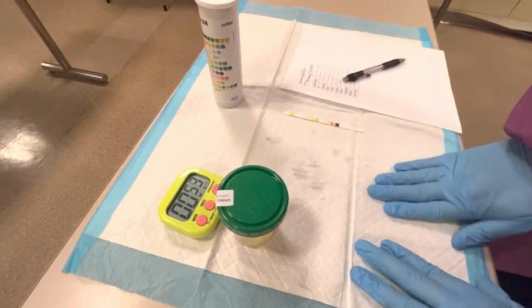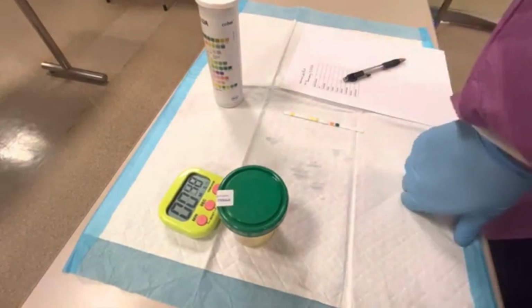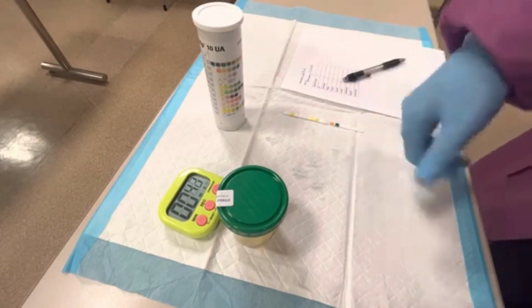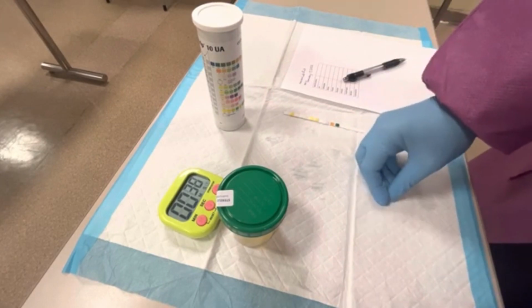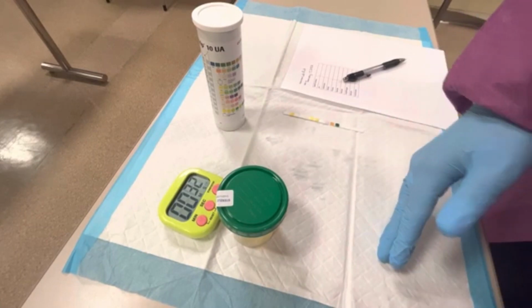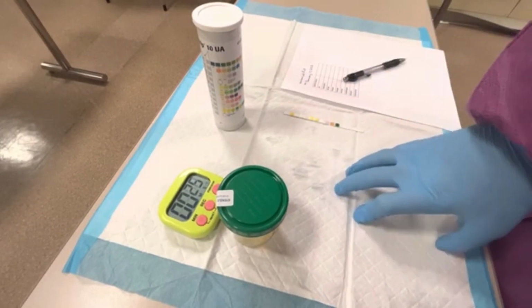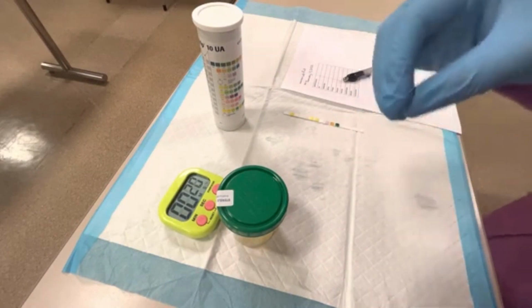So I said semi-quantitative. What does that mean? If we were doing a quantitative test, I would be saying, okay, the amount of leukocytes present in this sample is 102.37. It's an exact amount, all right? Now, a qualitative test is yes or no, or positive or negative for leukocytes, white blood cells. So this is a semi-quantitative test, meaning it tells you more than yes or no it's present, but it doesn't give you an exact number. It gives you a range.